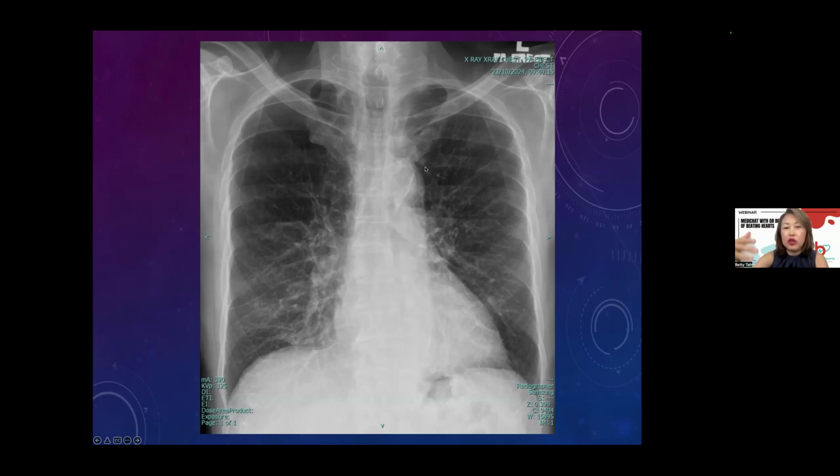So you go through your systematic review of every area. Despite having found an abnormality in a certain area, you still must go through every single step of your review, every area, right? Yes. That's the lesson here.